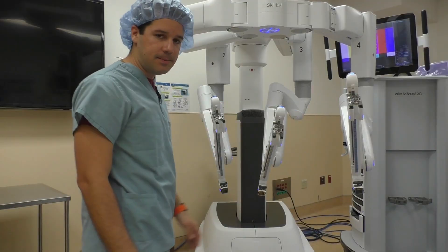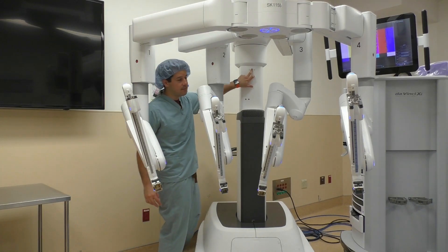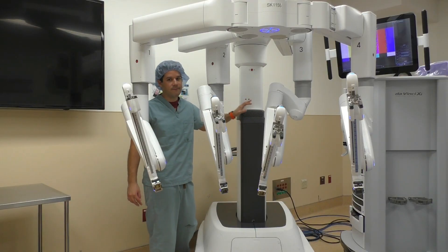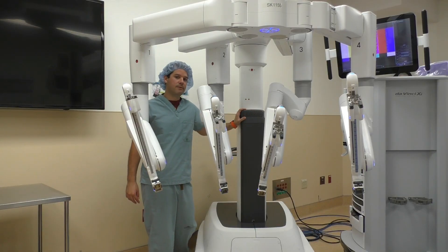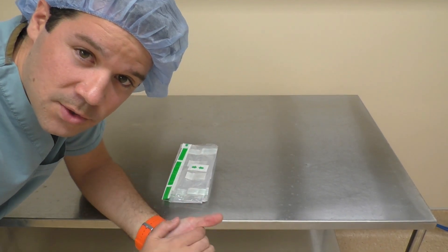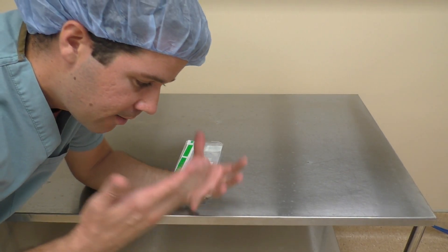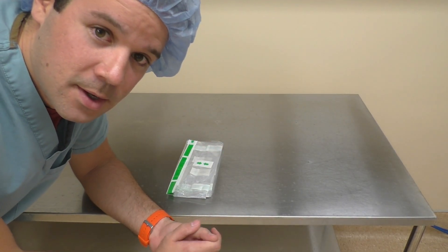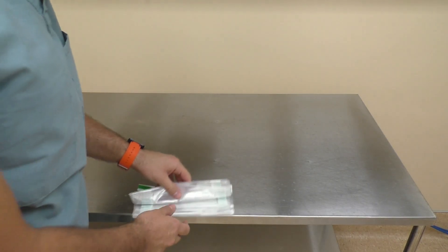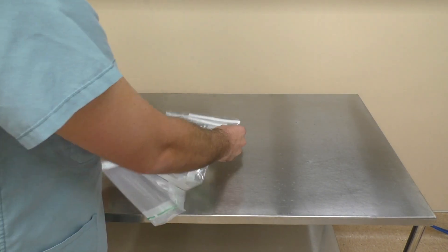When looking at this robot you might think you need one, two, three, four drapes — but that's not the case. We have a magnet right back here, and this is the column drape. It's important that you put the column drape on first — always put the column drape on first. I don't have a sterile setup, but I do have some extra robotic drapes, so I'm going to drape the column drape first. Obviously I'm doing it with bare hands, so use your imagination. This is our column drape — when you get it on your table, just open it up.